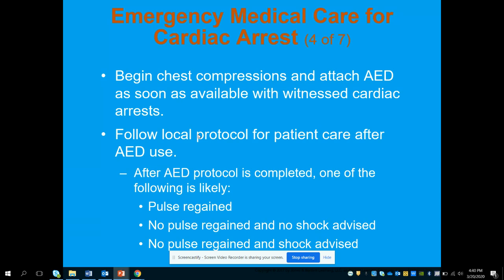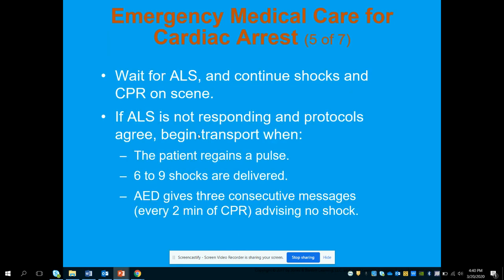So we're going to follow our local protocol, but we are going to immediately resume compressions after an AED has delivered a shock. And then we're going to continue on to the next 2-minute point where we would then potentially reassess the patient's pulse in a small window of time as we're preparing to change our compressors, but we want to have limited interruption or limited pause in compression. So making sure that we are checking that pulse, but very briefly to determine if we need to continue or not. If ALS is responding, then we are going to follow their lead as far as their treatment and protocols.